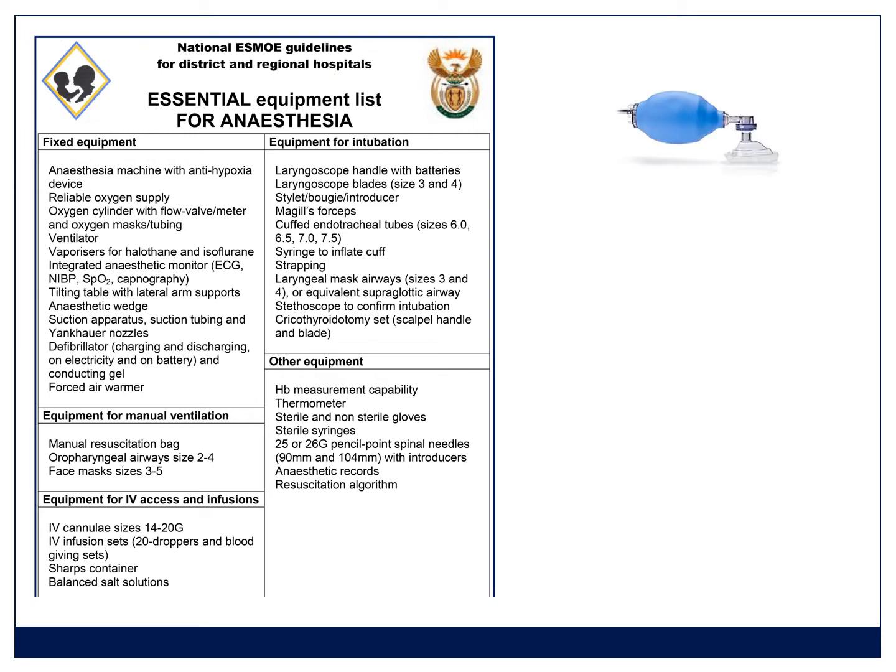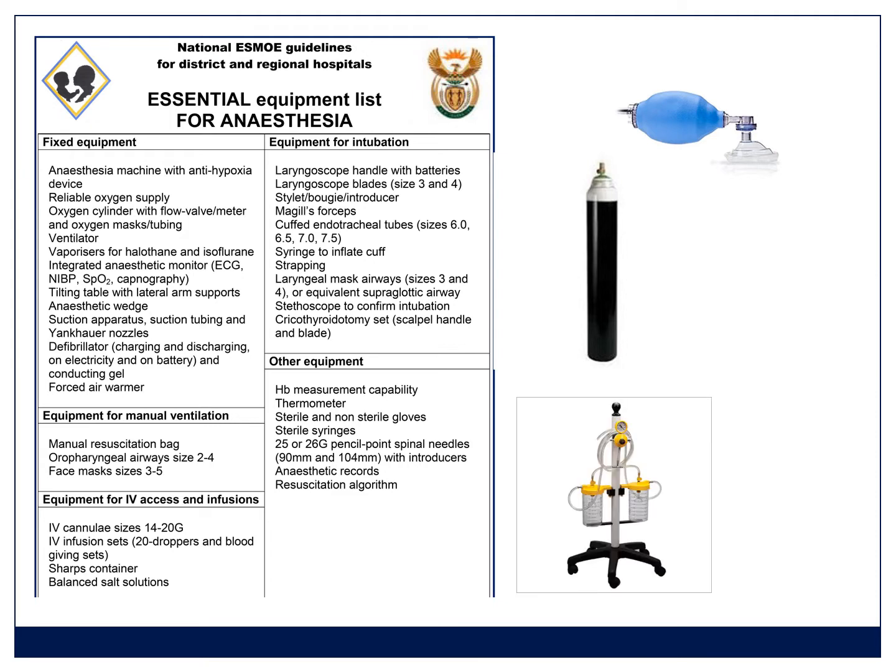You must be sure that you've got an ambu bag that is working. Test it. Include the patient end. Make sure you can generate a pressure. Make sure you have an oxygen source that you can attach it to. And just because there's a cylinder in the room doesn't mean it's got oxygen in it. Check the gauge. Make sure there's working suction, and that suction has a yankauer that you can use to actually suction material out of the airway if you need to. And if I walk into a theatre and one of those are missing, I don't start. You must have those elements present at the very least.